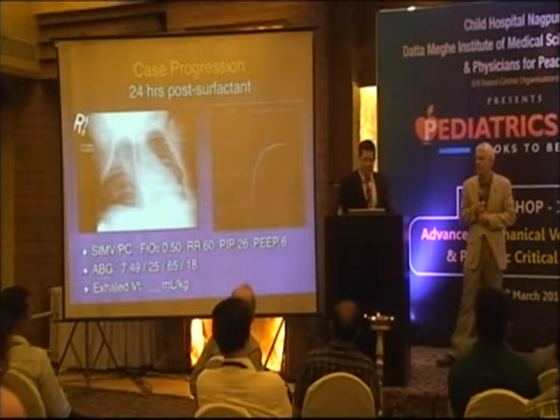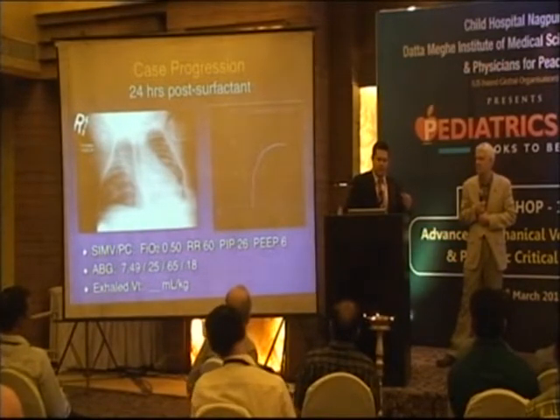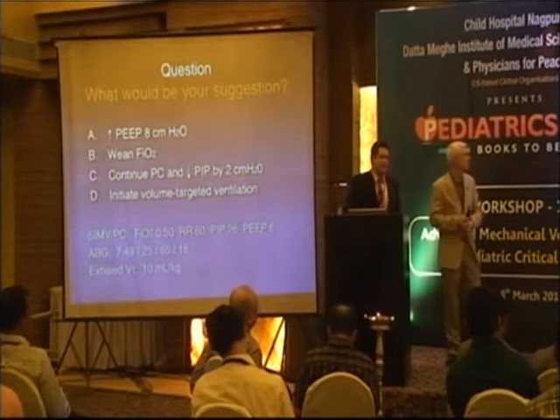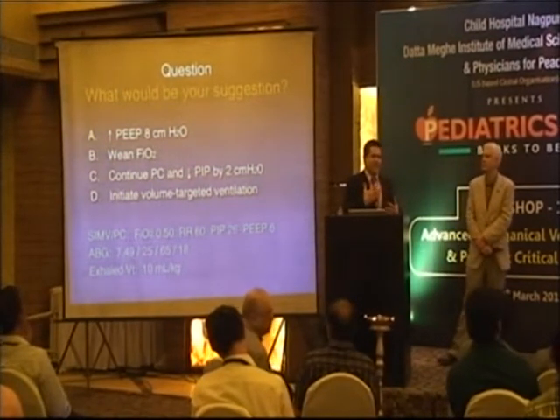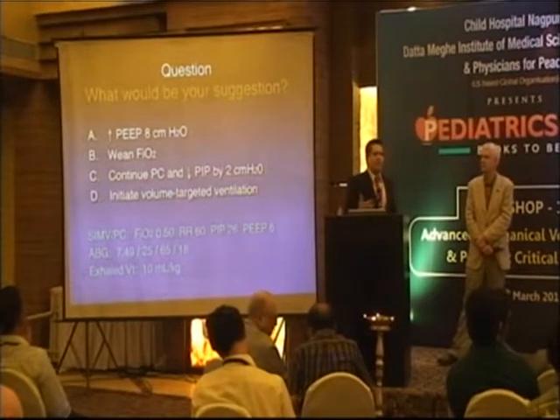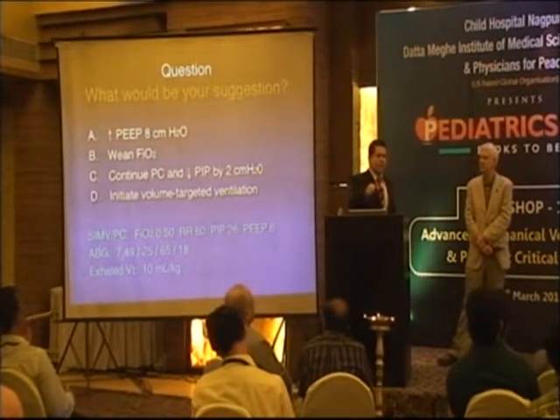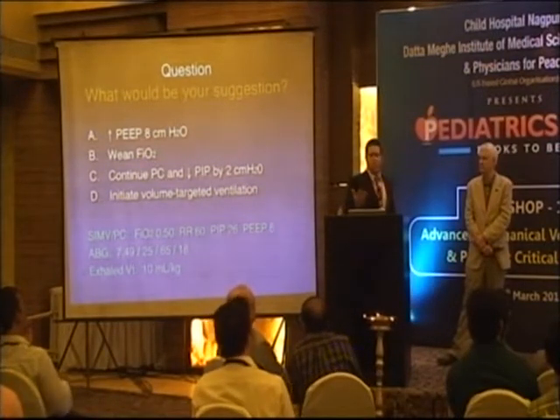So it's important that you not only monitor tidal volume, but also you try to measure gas exchange somehow, whether it's an end-tidal CO2 or capillary blood gas. But by now, we look at chest rise, and if your chest rise is excessive and you don't have the ability to calculate or monitor tidal volume on your ventilator, you need to turn that pressure down until you get minimal chest rise. Just roll with that.